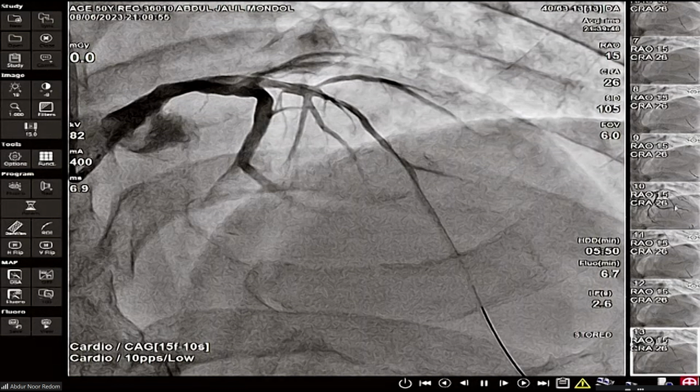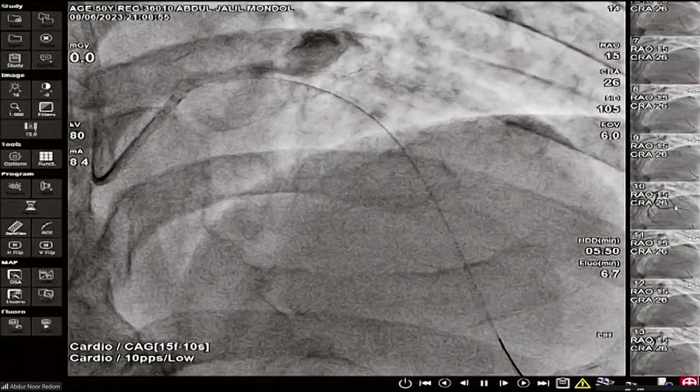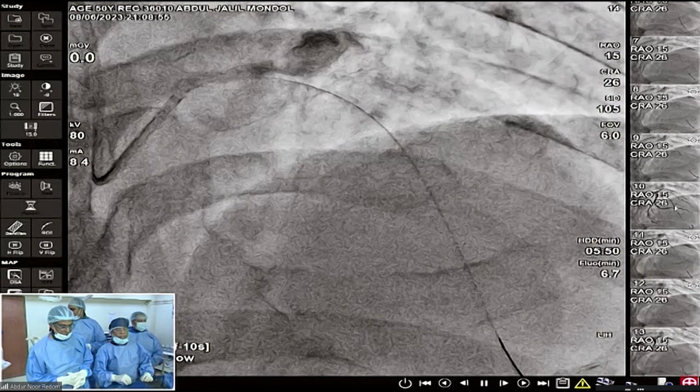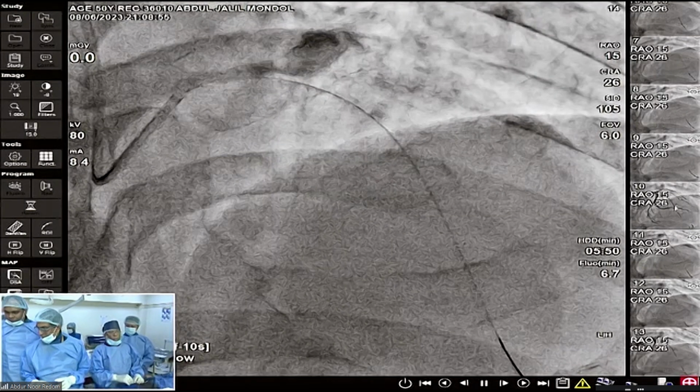But what is my feeling, my experience? If it is more than, suppose, 2.5 millimeter and a very good size vessel, I really want to protect it. Then I consider wiring. Exactly. Otherwise, I don't go for this. I don't even bother about the wiring. Yes, we agree with you, though the vessel length is longer, the diameter is less than 2. So no need. It is supplying less than 10% of the myocardium.